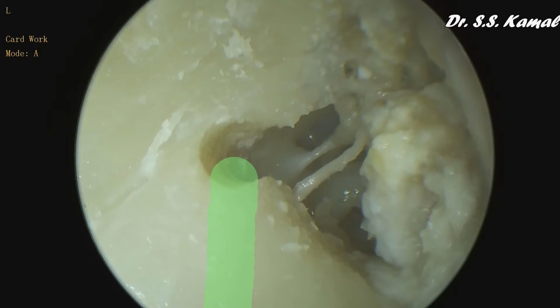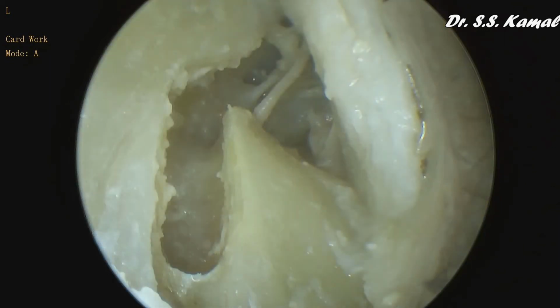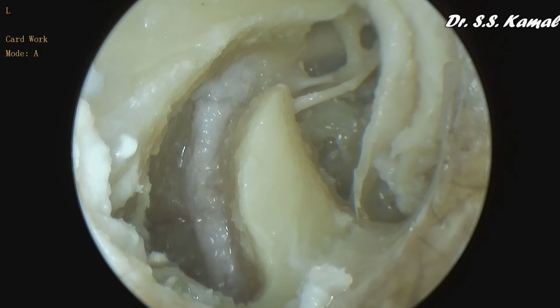The green area on the posterior canal wall, vertically running from the base of pyramidal eminence towards the floor of external auditory canal, is indicating the presumed area of mastoid segment of facial nerve. A progressive dissection along this vertical plane from lateral to medial direction ultimately exposes the mastoid segment of facial nerve from genu to stylomastoid foramen.